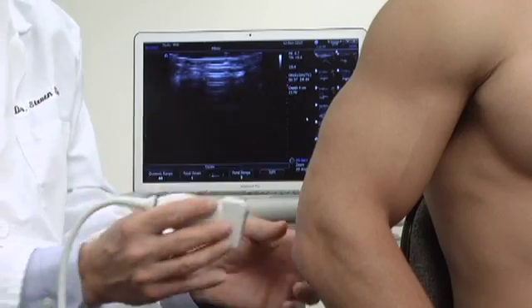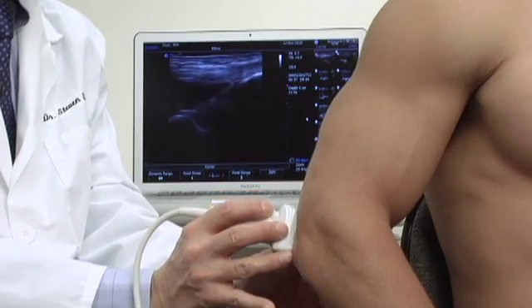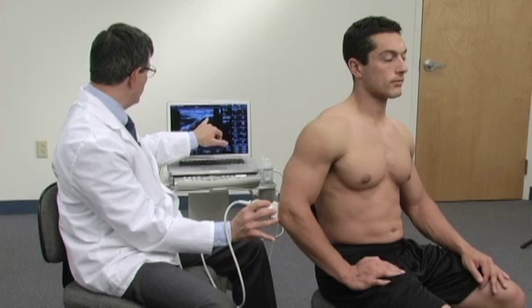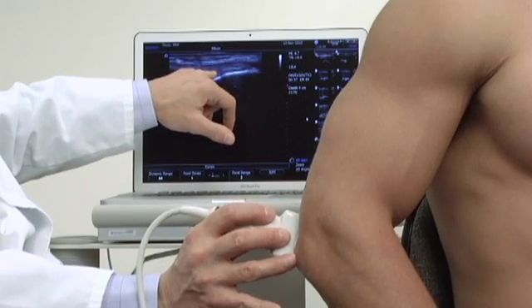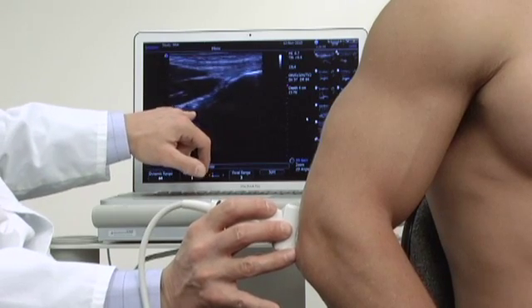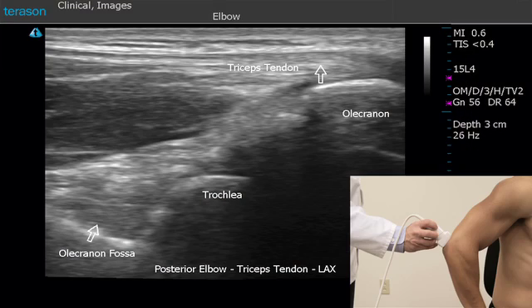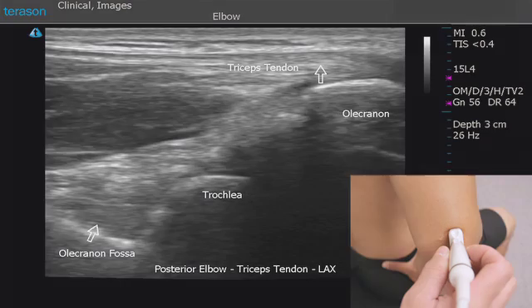To do that we'll place the notch of the probe towards the head and place the distal end of the probe directly over the olecranon. Screen right represents the olecranon. Above that we can see the triceps tendon, with the triceps muscles beginning here. This area represents the olecranon fossa, and the bright area within it is the posterior fat pad. Effusions within the elbow will cause that fat pad to be displaced posteriorly.